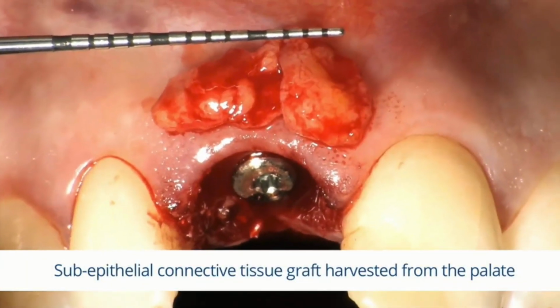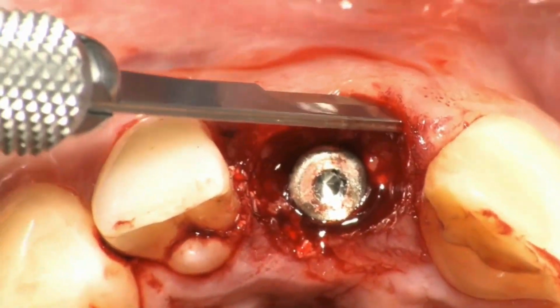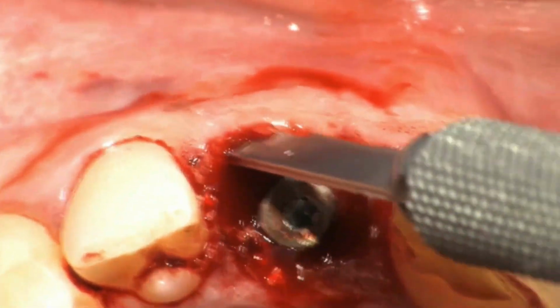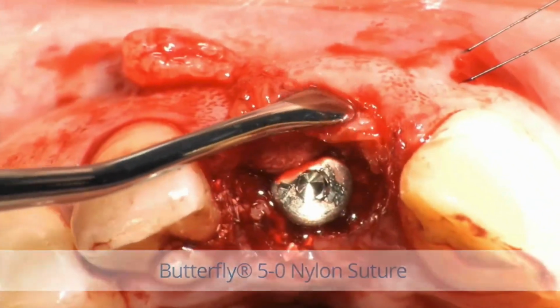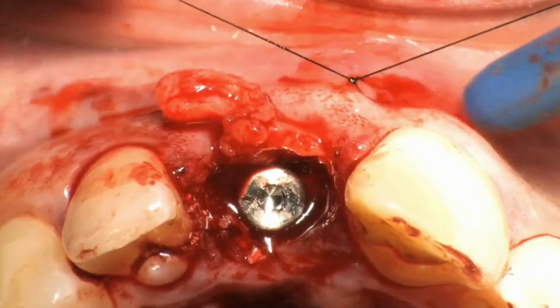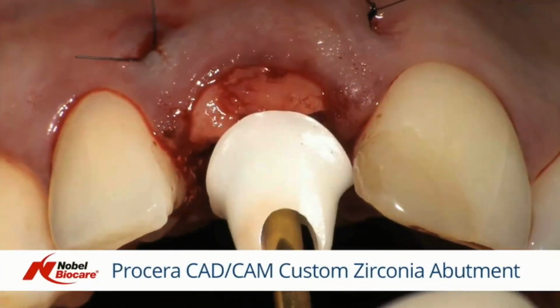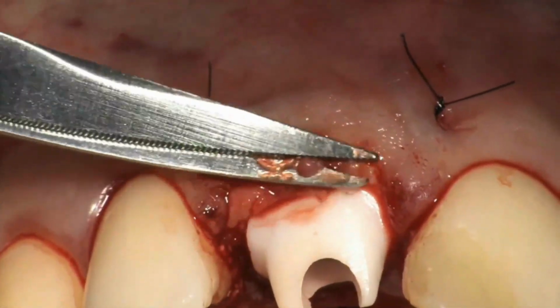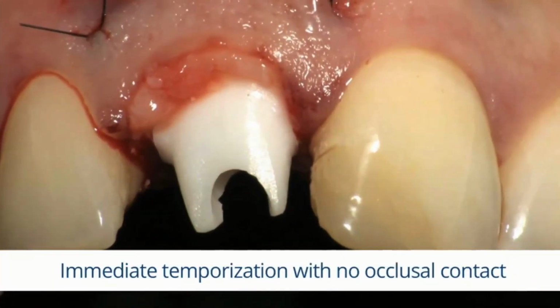Then we're supporting this treatment with a connective tissue graft harvested from the palate. This can be from the palate, this could be from the tuberosity. We're making a small tunnel on the facial just so we can place the connective tissue stable with some sutures into the site. And you can see how actually the connective tissue graft is sutured right between the internal side of the buccal soft tissue flap and the abutment. So you don't need to go where the bone is, you just need to be supracrestal.